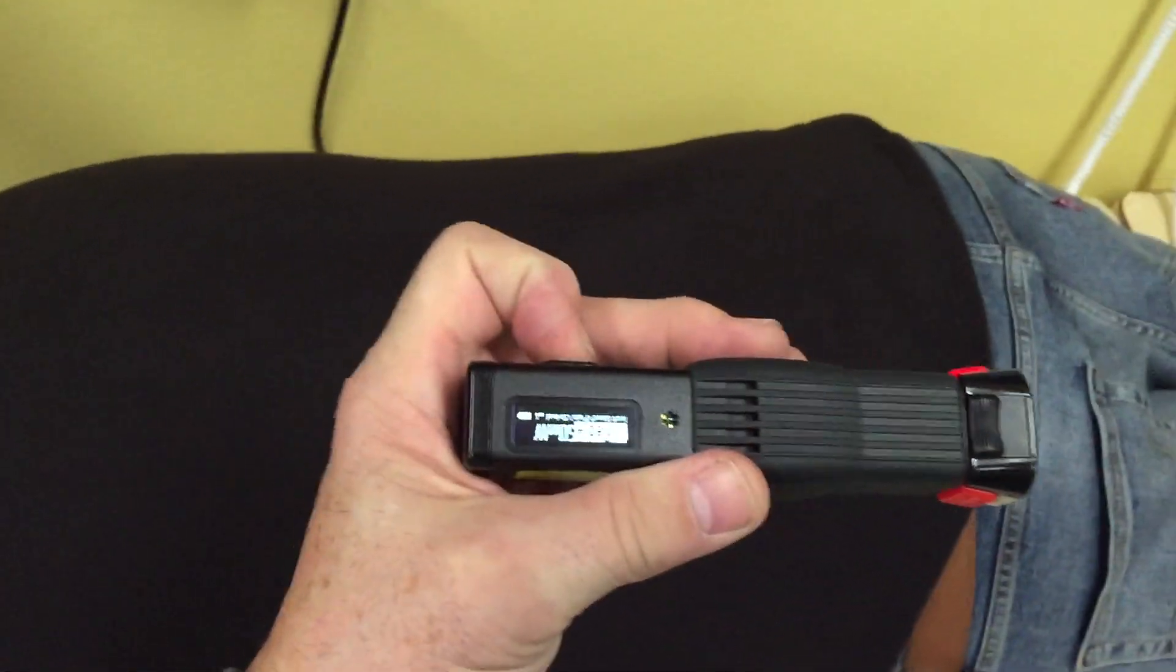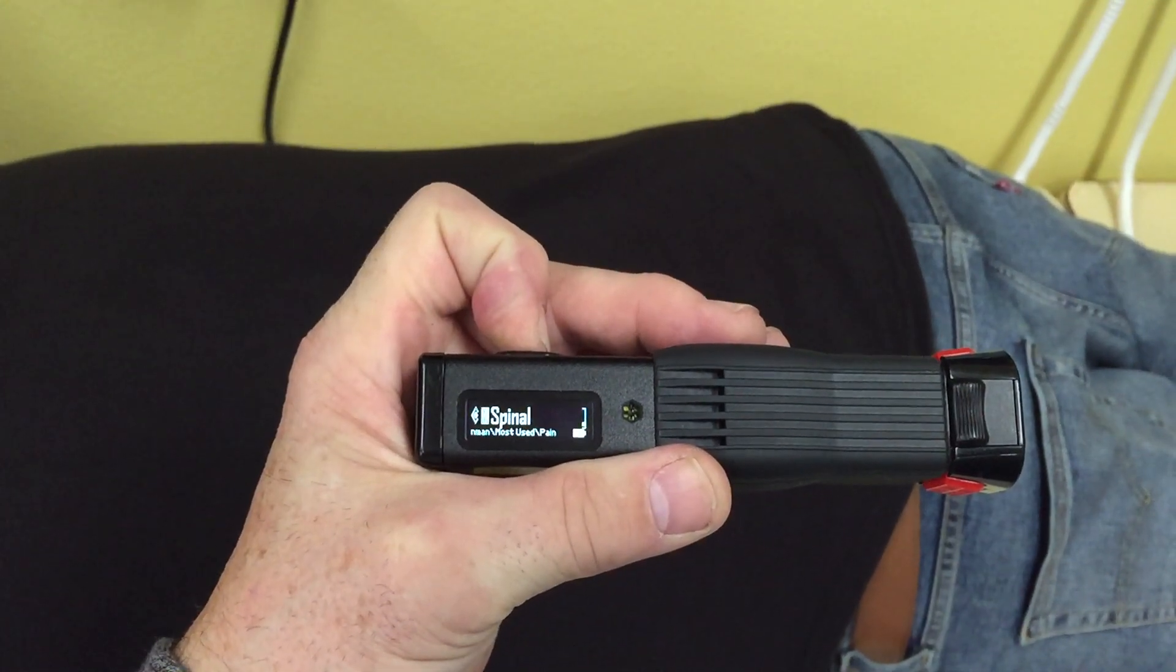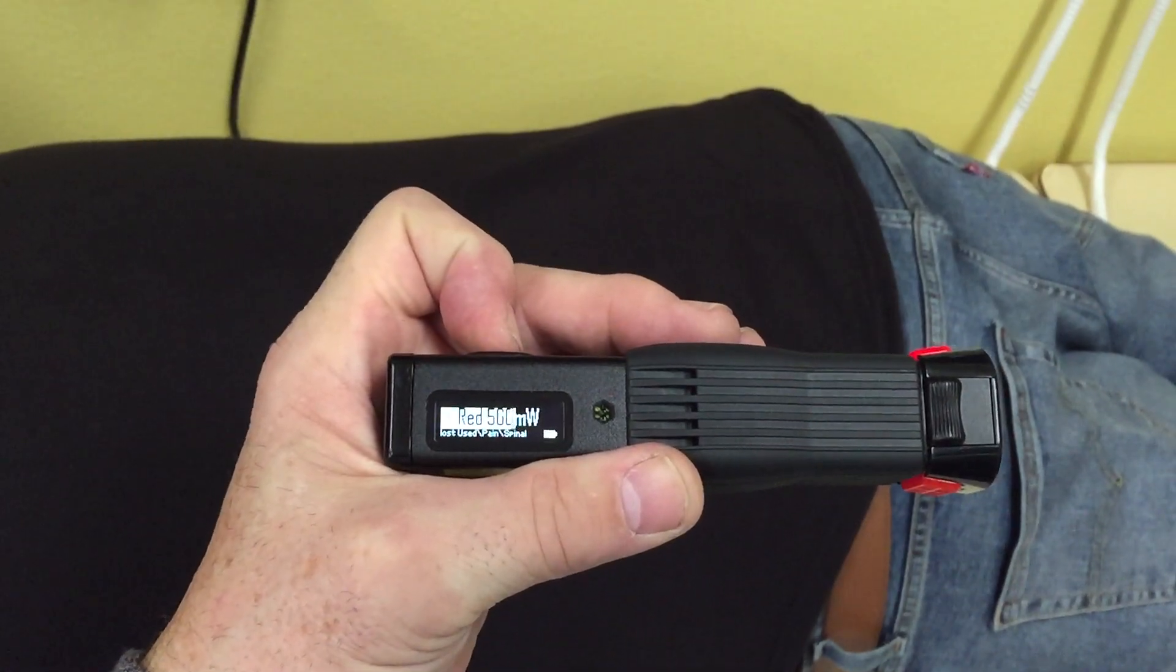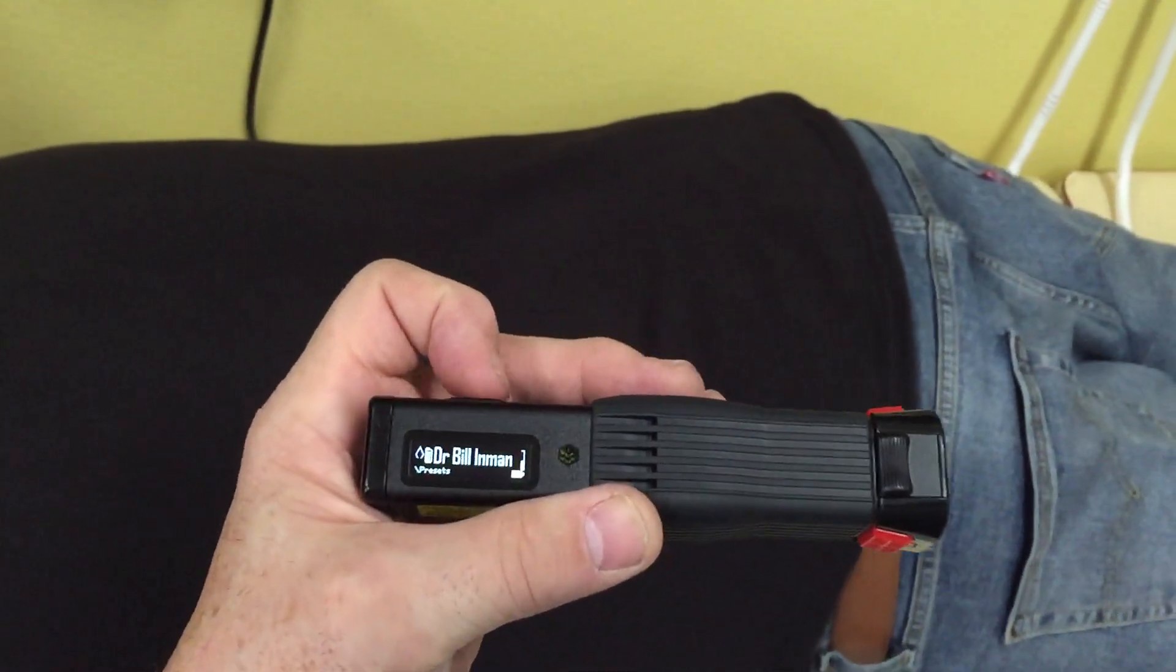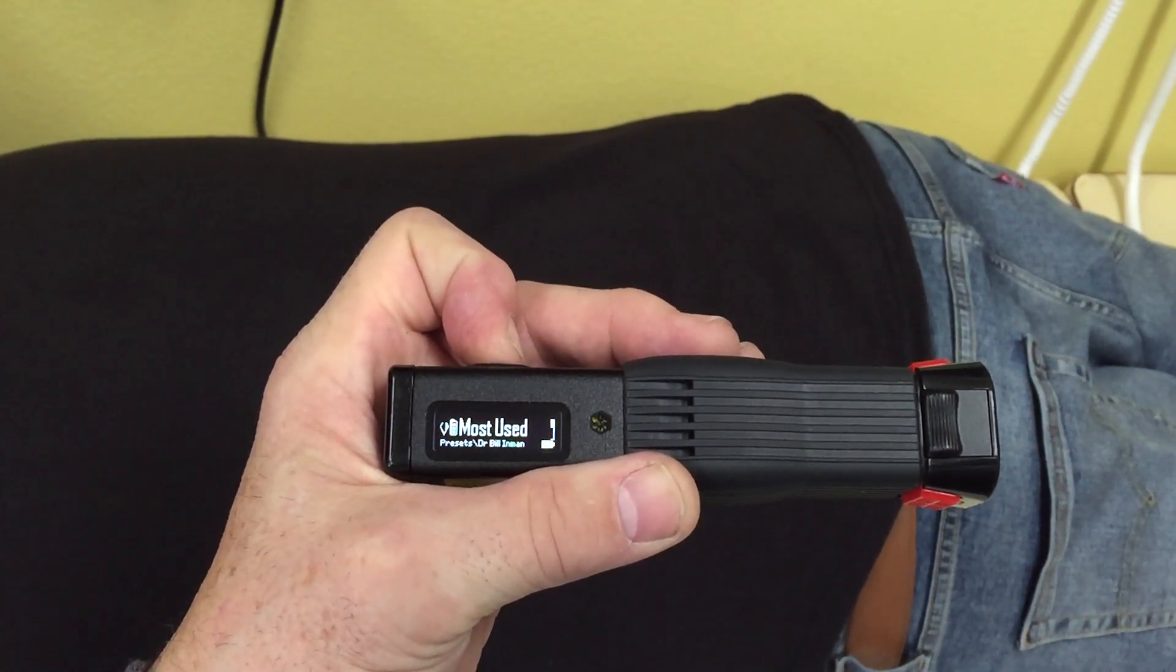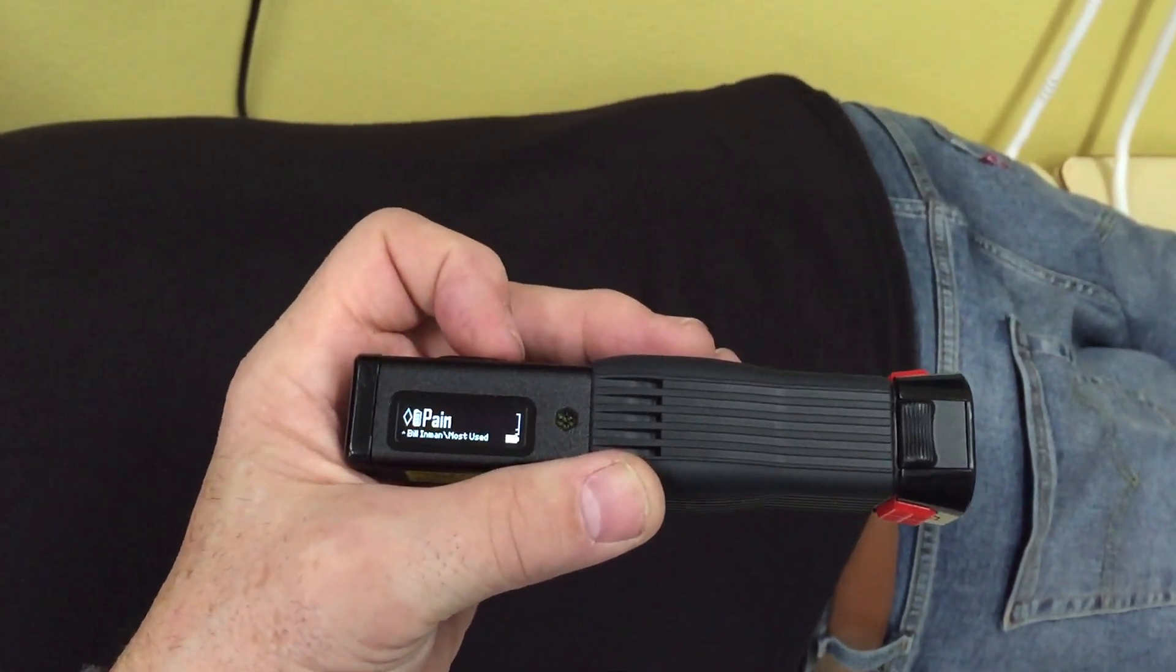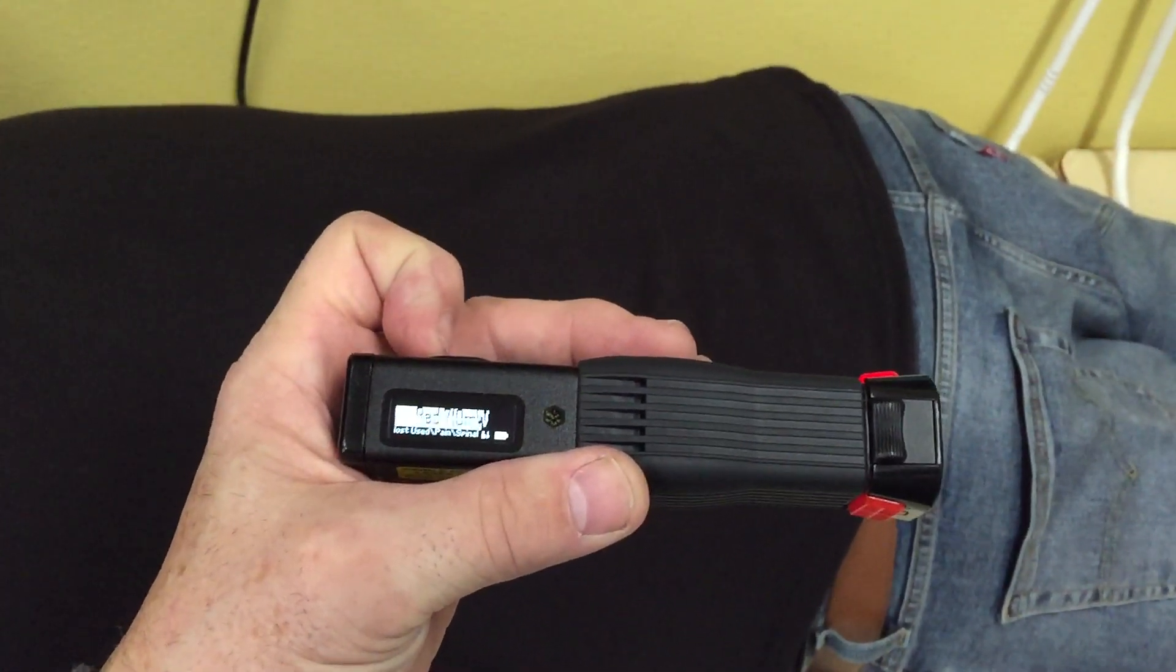What we've done before I hit the button was utilize this particular laser, which I will turn off and turn back on. So this pain—pain for spinal—is what we're going to use.